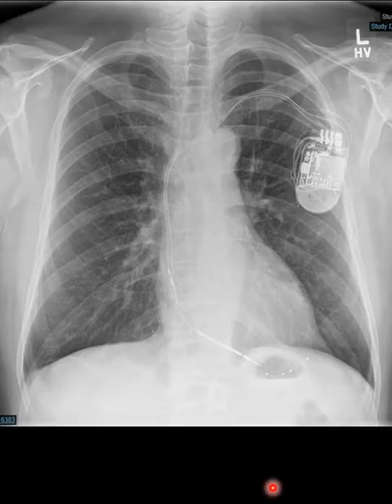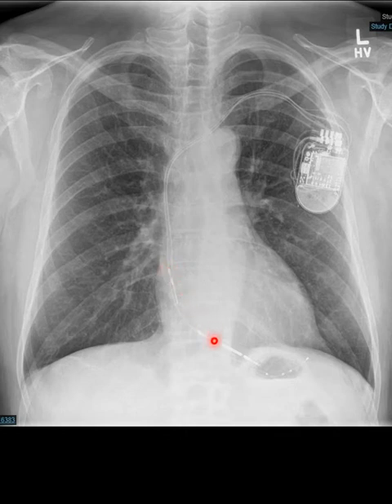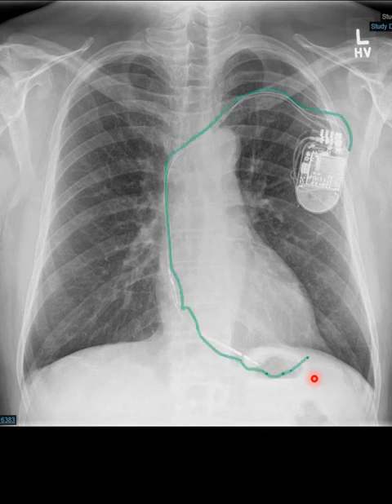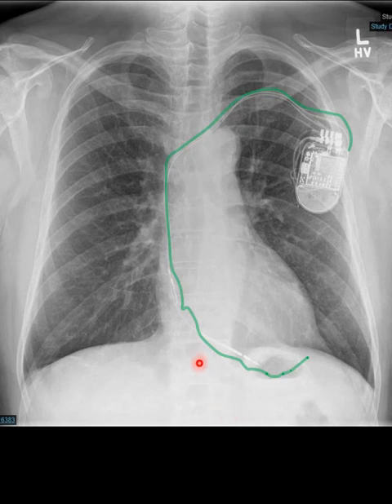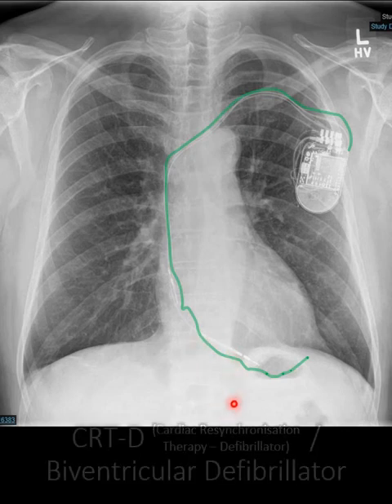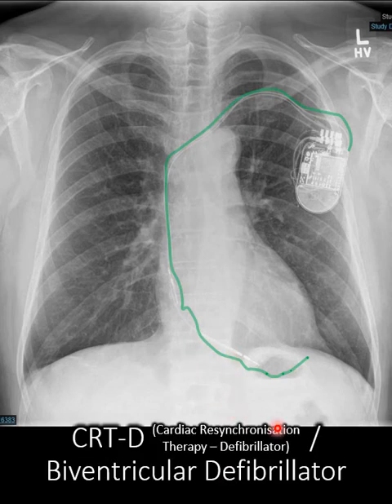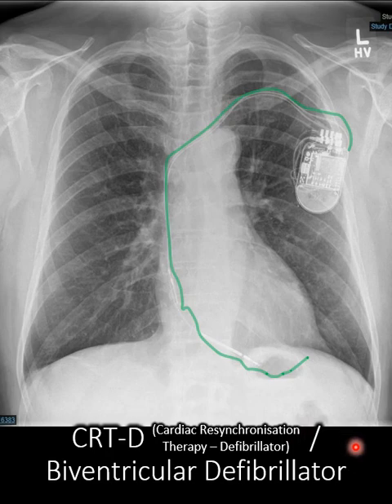This time we have one, two, and harder to see, three leads. We are limited by the anatomy and this quadrupolar lead has probably been put here because there weren't any good veins to put it down elsewhere. Again we have a thick coil, so this is a biventricular defibrillator device.